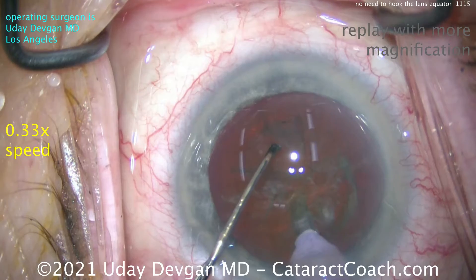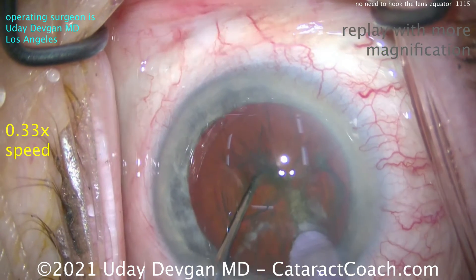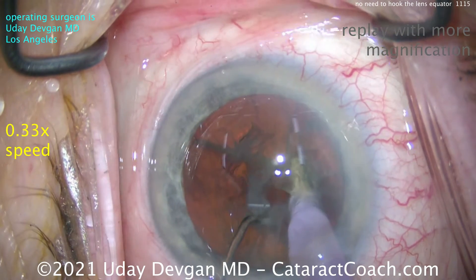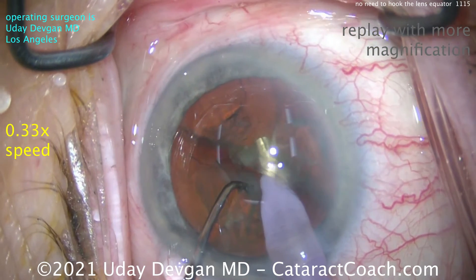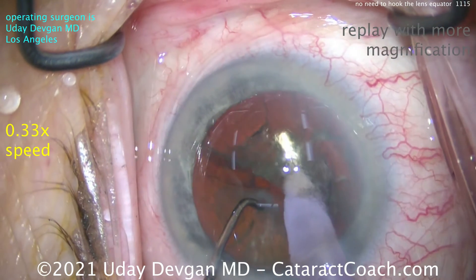Now let's watch it in slow motion at one-third normal speed. We push the phaco probe in, the chopper is pushed in, the two instruments are brought together, and then split apart — two halves are achieved very nicely. A little extra separation makes sure the halves are freed from each other, and now we can go on to sub-chop the rest of the nucleus.